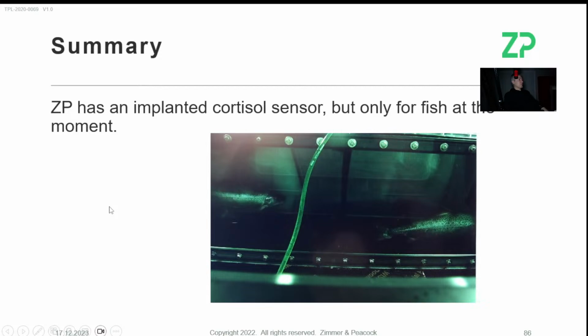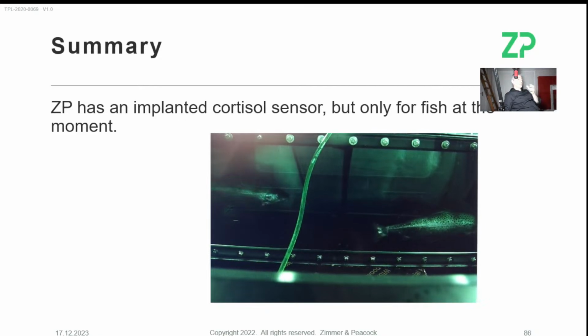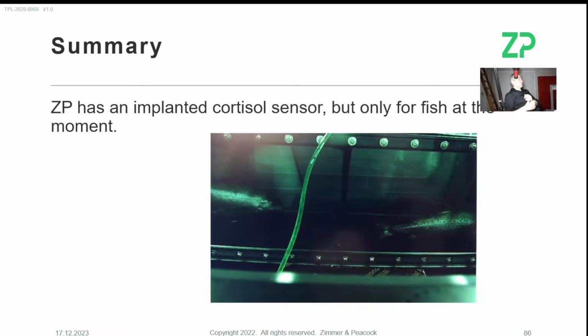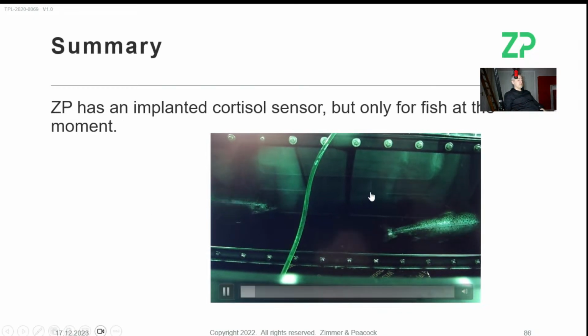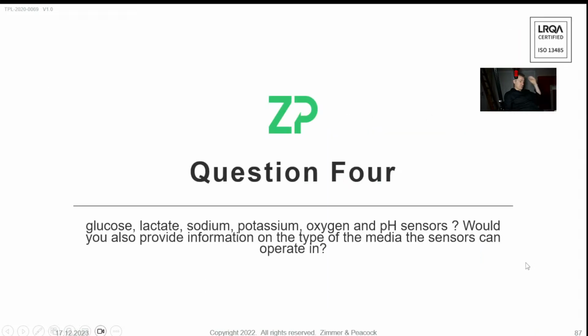So in summary, we do have a cortisol sensor. It actually is used in fish. It's more interesting to do hormones in what I call an IVD, a point-of-care test. I have done a little bit of work on testosterone, for example, in saliva. So you essentially get some saliva, put it on the sensor, get a result. That is much more achievable. But to make a cortisol sensor that's ready to go on a human being now, that's going to take a lot more funding, and we're not in a position to really get involved unless the funding's in place.